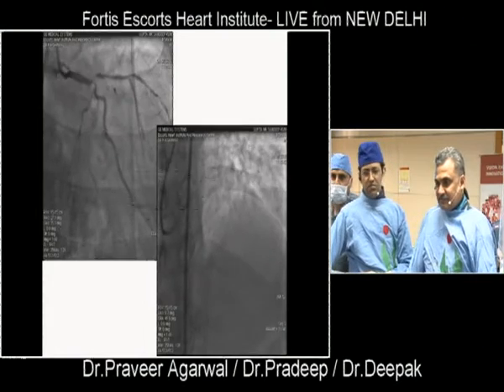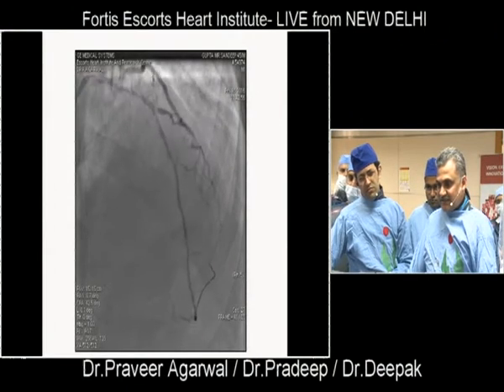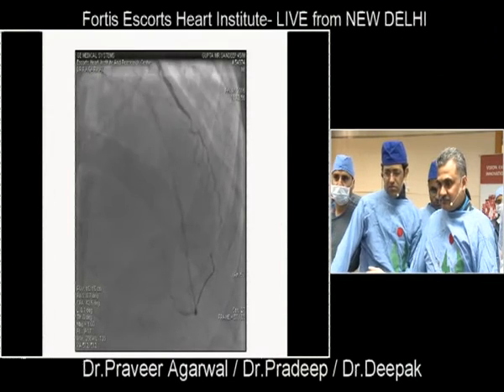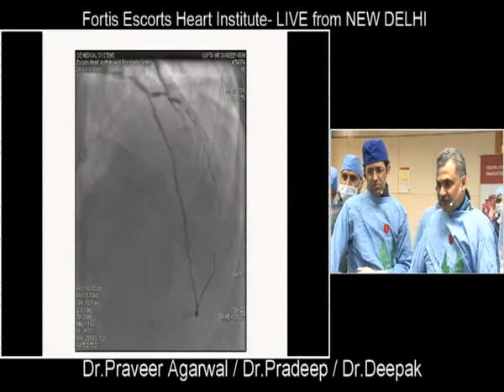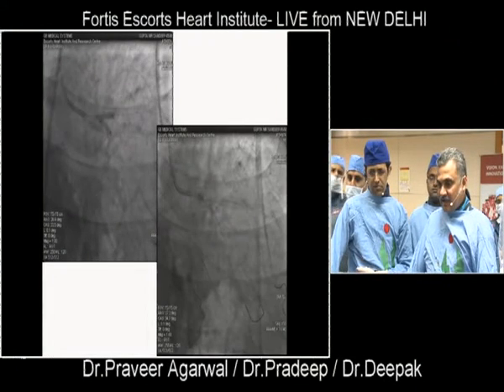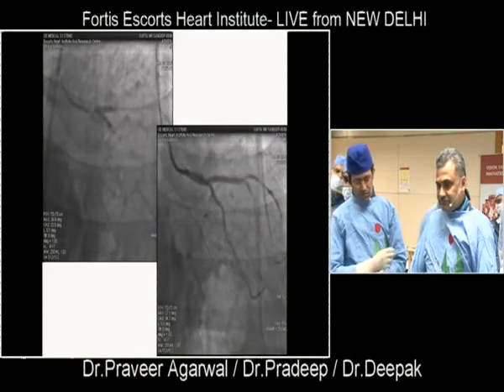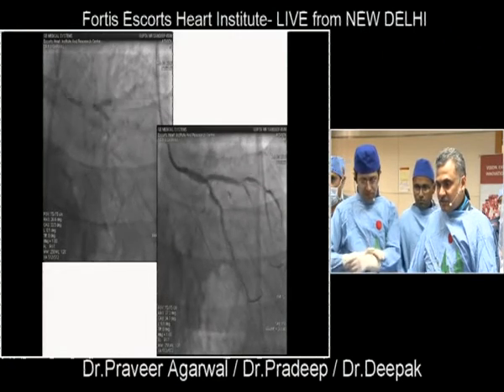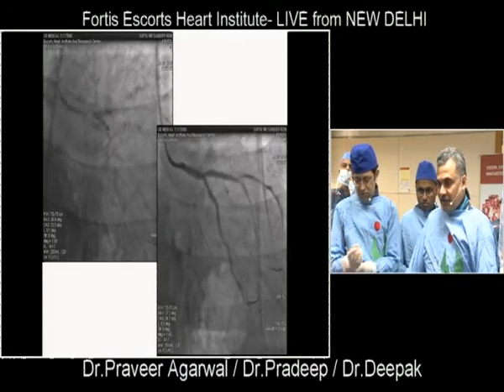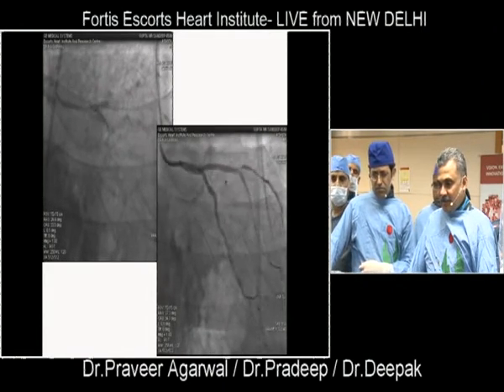Can we have the next slide, please? So this was February. First the distal stent was placed. This was a 2 millimeter into 19 millimeter Biomime Aura with very thin struts. Next, please. And this is the bifurcation that we made with a partial crush technique. The end result was reasonable. The patient remained asymptomatic for nearly 2.5 months. But again, he had similar symptoms.